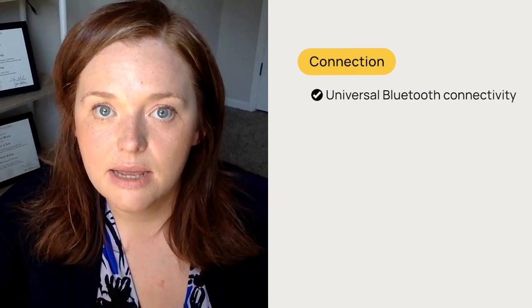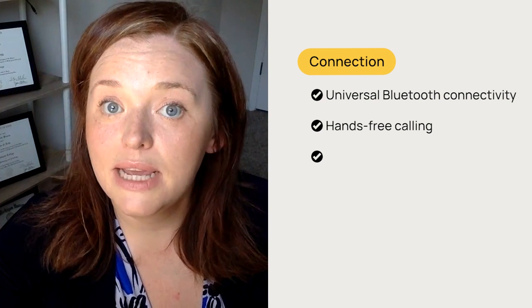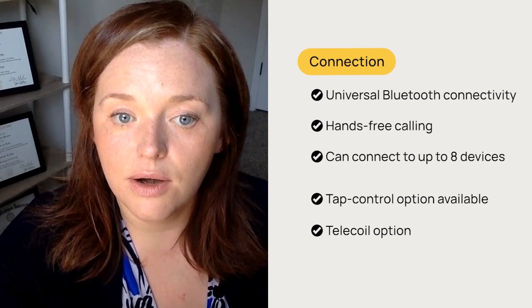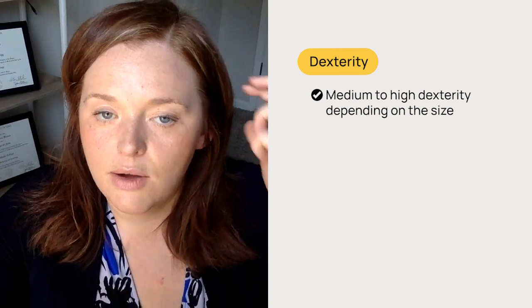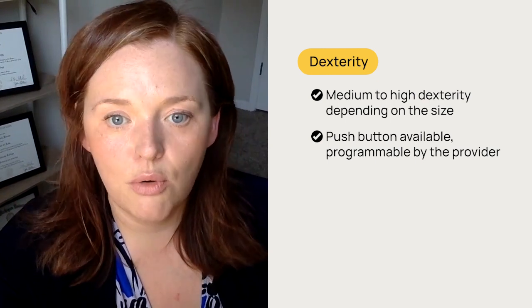Connection-wise, you have some great options here with Bluetooth. They have universal Bluetooth connectivity, so you can connect practically any Bluetooth device. They have a hands-free option — if you'd like to answer with that tap feature, you can take hands-free phone calls. You can be connected to multiple devices — two at once — and up to eight total devices can be paired. You have that tap control and a telecoil option. For dexterity, this hearing aid has medium to high dexterity depending on which size you have. You'll need to be able to put it behind your ear and then place that piece in the ear canal. It does have push button options that can be programmed to change the volume or change the program — you've got that toggle switch.